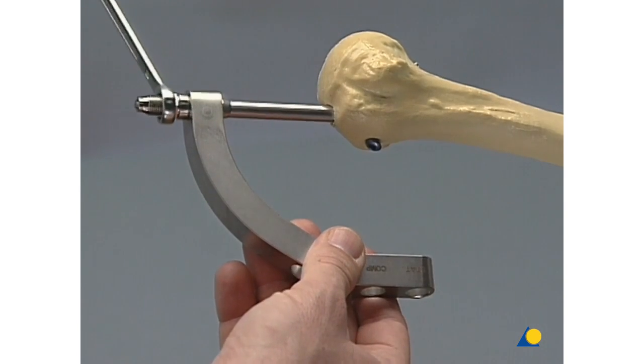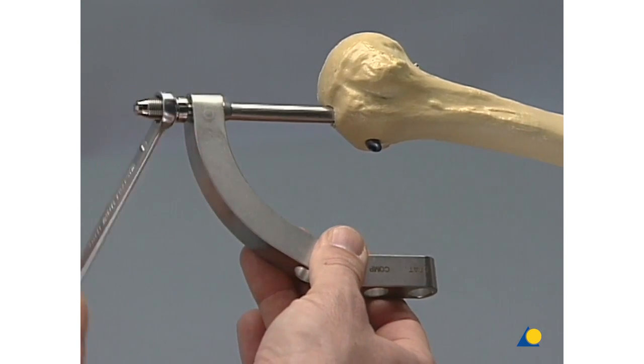To remove the insertion handle, loosen the connecting screw using the combination wrench.